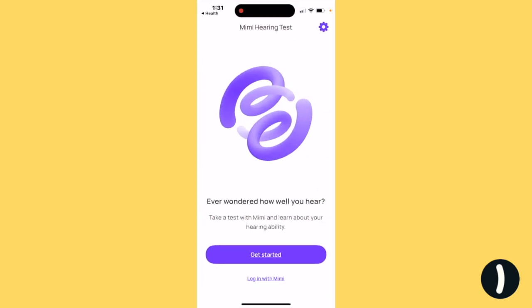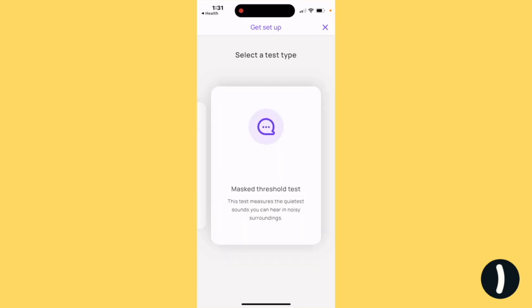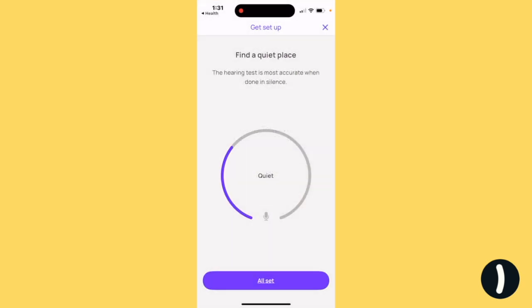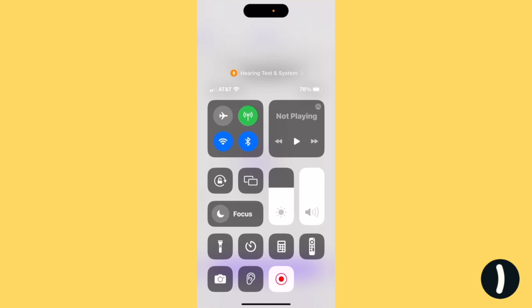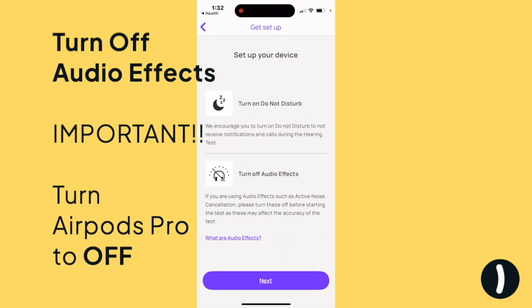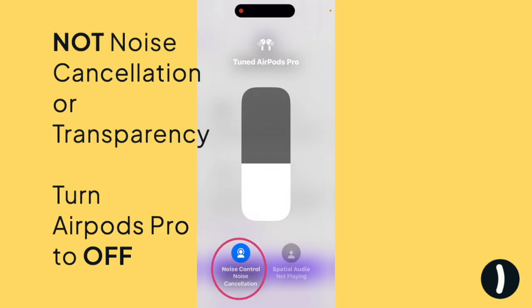Open it up, get started, test your ears. We don't want the masked threshold test — we need the pure tone test. Allow all the permissions. Now connect your AirPods Pro. Next, set up your device. This is important: you've got to put your AirPods into off mode, not transparency and not even active noise cancellation or ANC, otherwise it can significantly affect your test results.